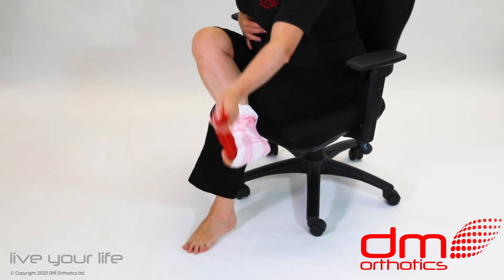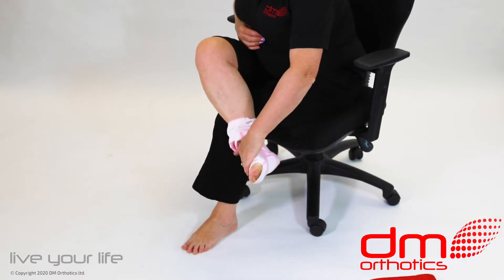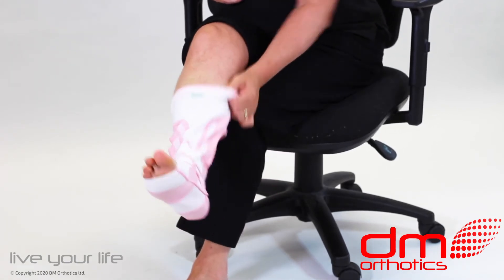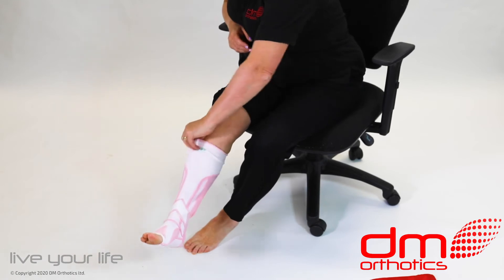Remove the silk applicator. Continue to roll the sock up the leg until it is in position just below the knee. The DMO label will be at the front.